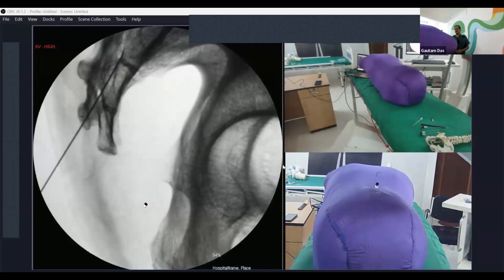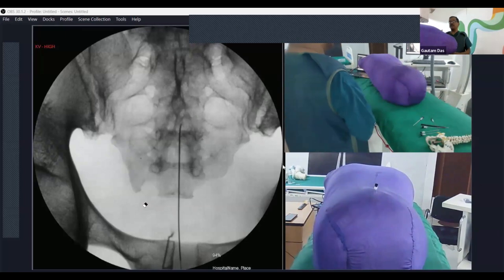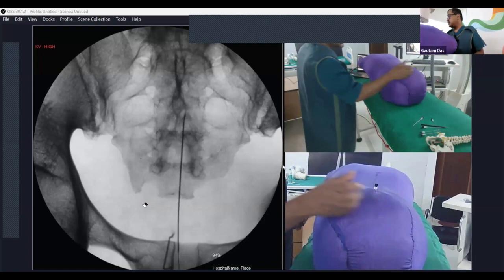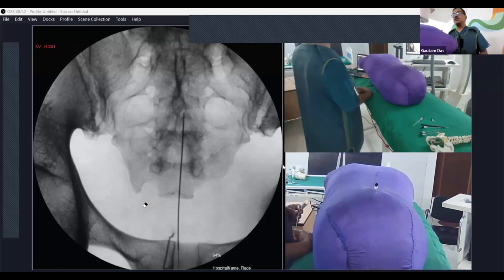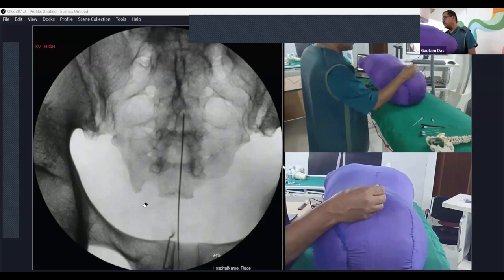Check by the epidural, and advance further. How much should I be advancing? Between the S3 and S2 junction, because the lower border of S2 and S3 is where the dura extends. So you should be at the junction. I can advance the needle a little more.